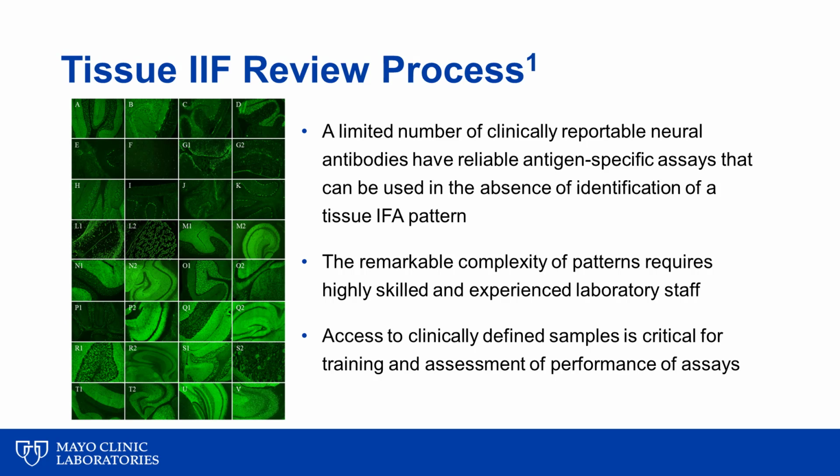In addition, the utilization of a pre-absorption step can reduce the amount of these non-specific antibodies. This improves the detection of lower titer antibodies and eliminates the unnecessary excessive reflex testing that may occur due to interfering non-specific antibodies.